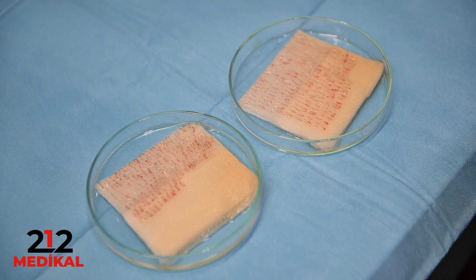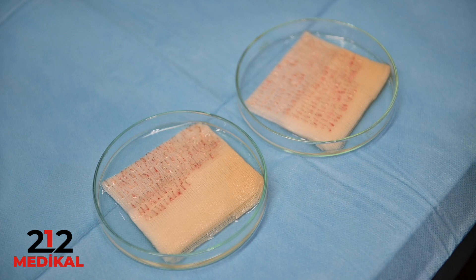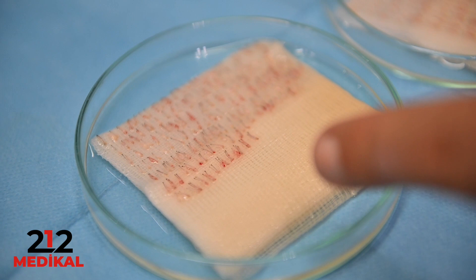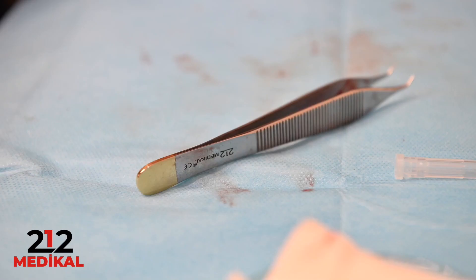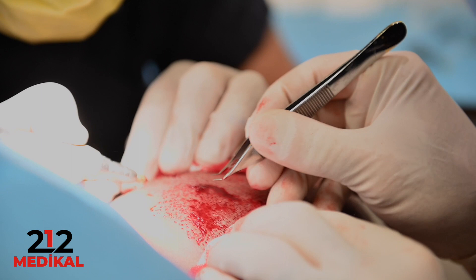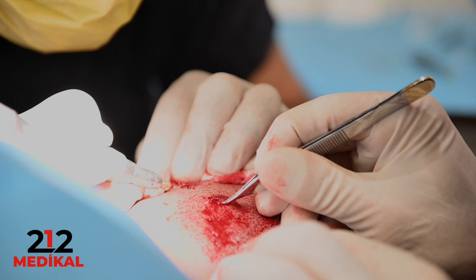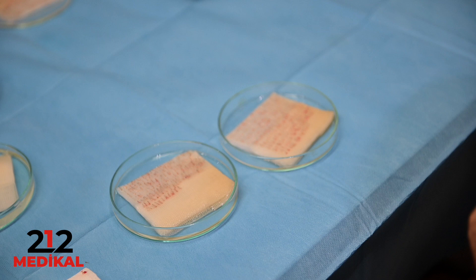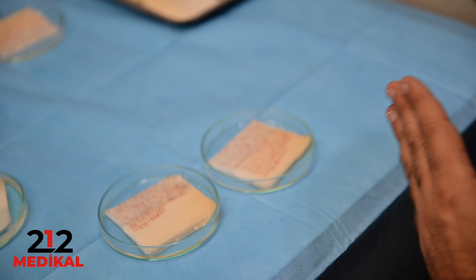After extraction, we clean the grafts — removing blood and any debris. Then we sort the grafts: single-follicle grafts, two-follicle grafts, and three-follicle grafts. This sorting is very important for implantation because it allows us to create a natural appearance — using single-follicle grafts at the front hairline and two- or three-follicle grafts in other areas.